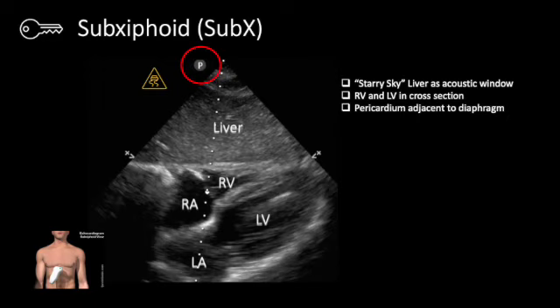Our imaging checklist, regardless of which side the probe indicator is on, includes the relatively homogeneous gray, starry sky looking liver in the near field, with a hyperechoic or bright diaphragm and pericardium, which are usually indistinguishable from each other, separating the right ventricle from the abdomen.